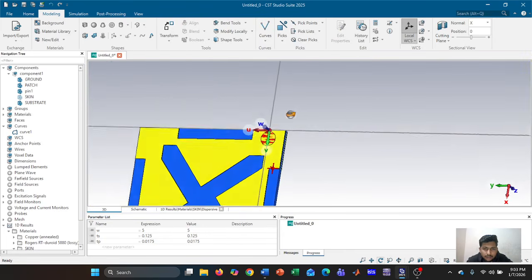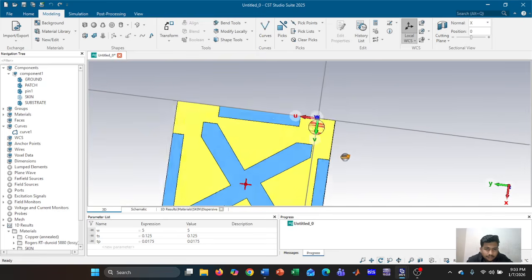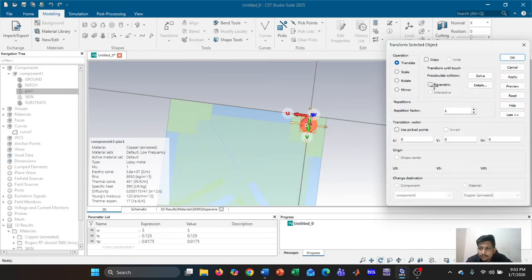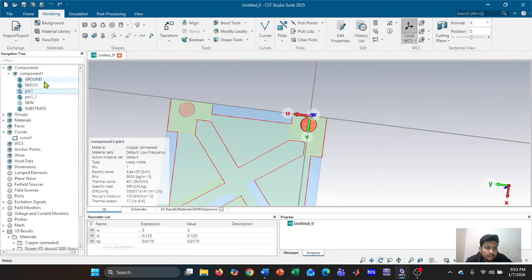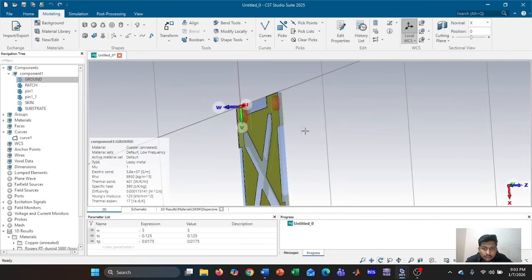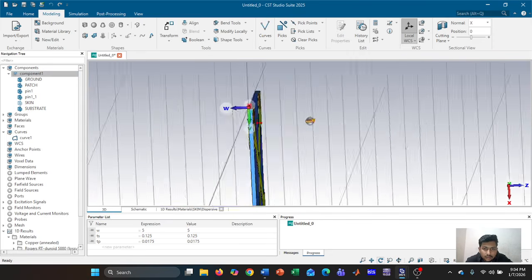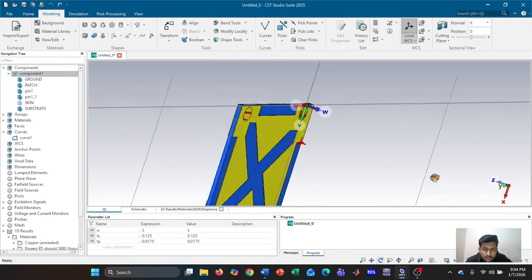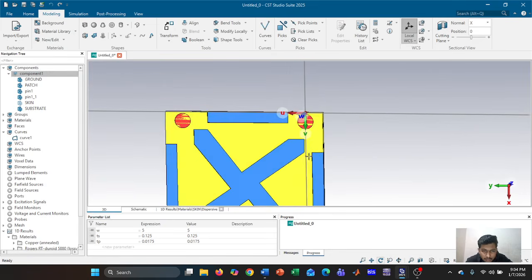So let's make another shorting pin. Select pin, transform, copy, and this side, apply. Okay, so this is our two shorting pins to connect the ground patch and the main patch together.